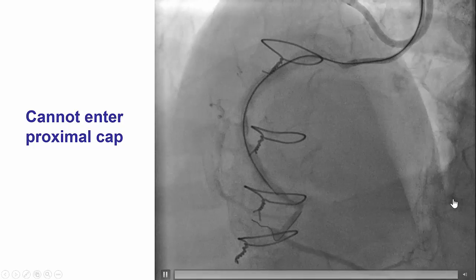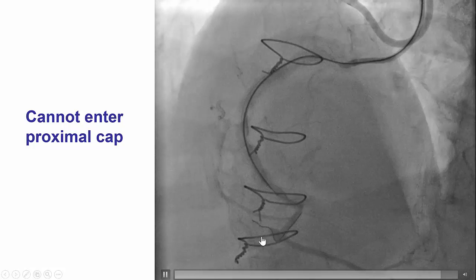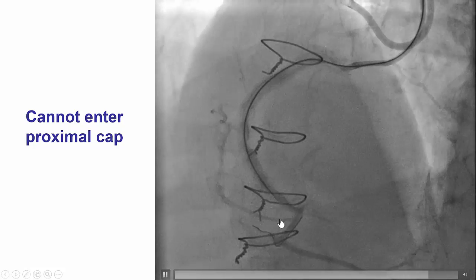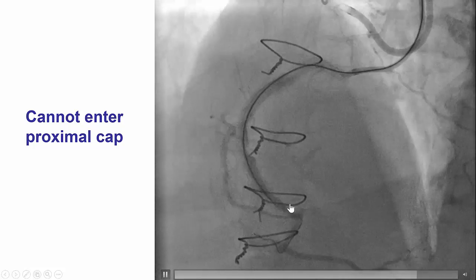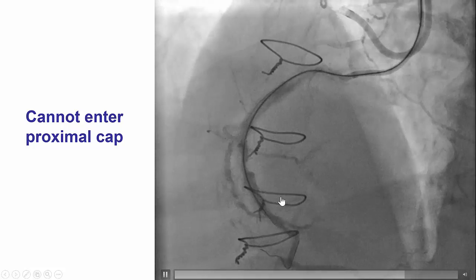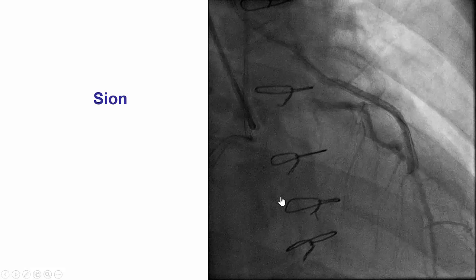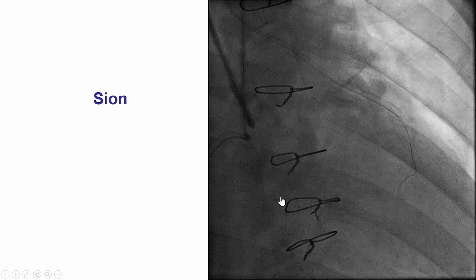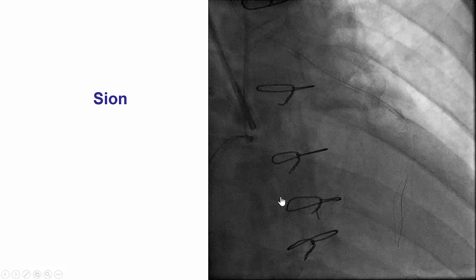After doing that, we inserted the wire into the PDA going antegrade into the vein graft stump, and then attempted to cross antegrade using multiple wires through a Corsair Pro microcatheter. Unfortunately, this failed and we could not penetrate into the occlusion. Therefore, we changed to the retrograde approach.